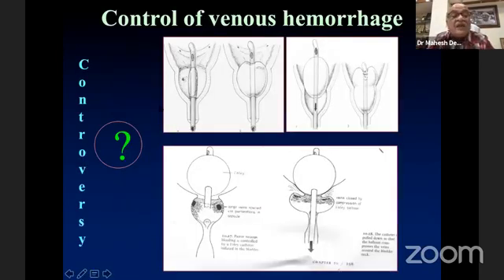Now at the end of the procedure is where to put a catheter. Never put a catheter in the capsule, into the fossa. The patient will have lots of pain. You might be able to control the venous bleeding, but if there is bleeding, you control it. Otherwise, this is venous bleeding, not arterial bleeding. You put a balloon into the bladder, increase the balloon to 30 to 35, and then pull it. The whole prostate collapses because you have removed the transitional zone, and the bleeding will stop, and that will be fine.